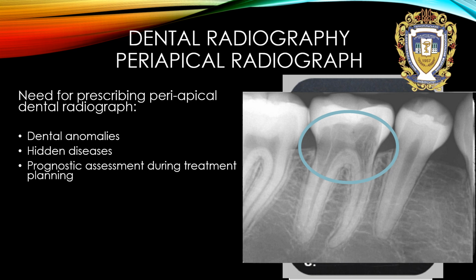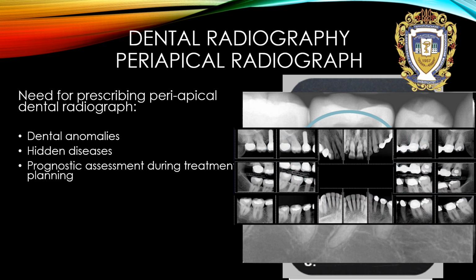Prognostic assessment during treatment planning. For this purpose, we need to take many periapical dental radiographs and complete them with a special chart to observe every tooth.